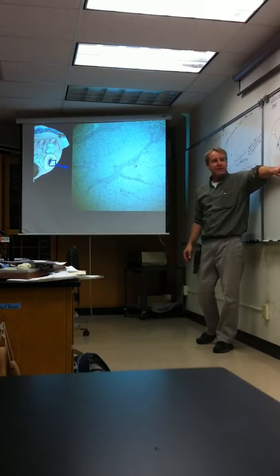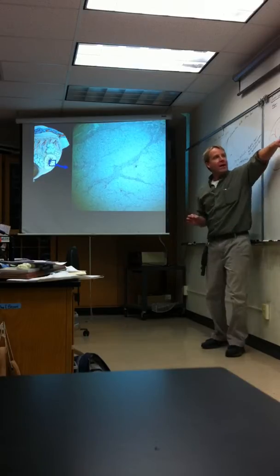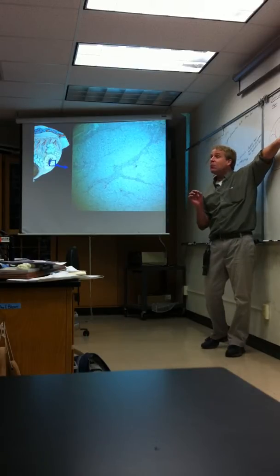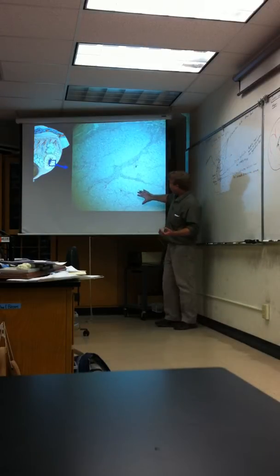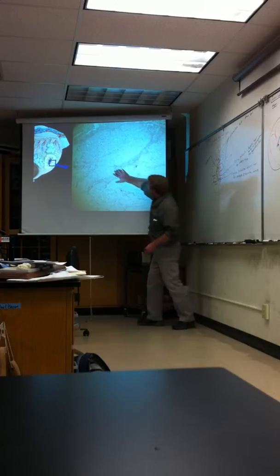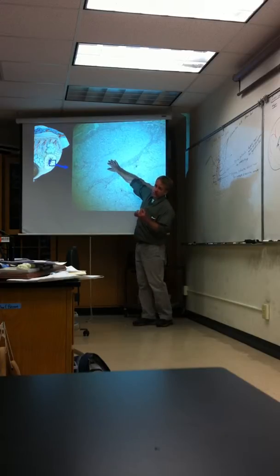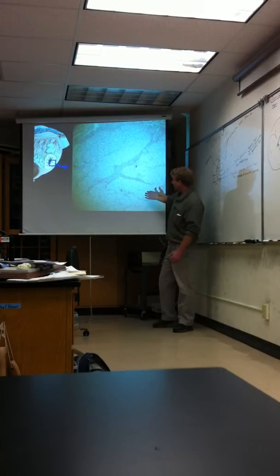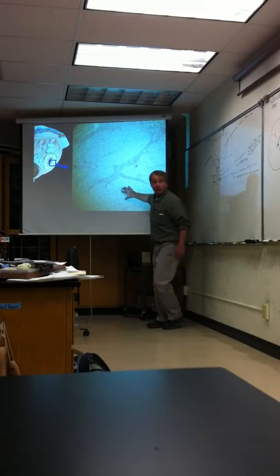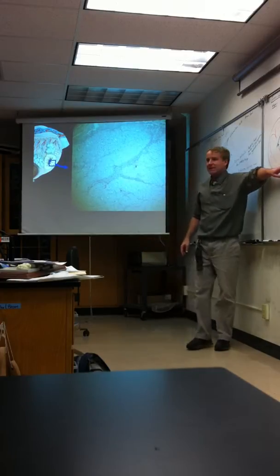They're called theca lutein cells because these cells were the theca folliculi. You have the granulosa lutein cells because they were the granulosa cells. So when I'm looking here, the most abundant cell, all of these light pink cells here, are the granulosa lutein cells. They used to be granulosa cells, but then after ovulation, it became the corpus luteum, and now you have the granulosa lutein cells. These darker ones here used to be the theca folliculi, but now they are the theca lutein cells.